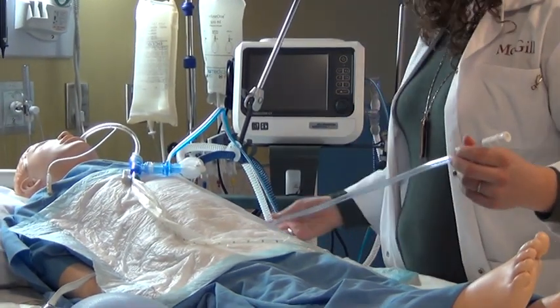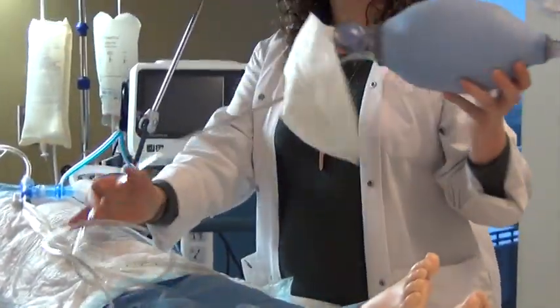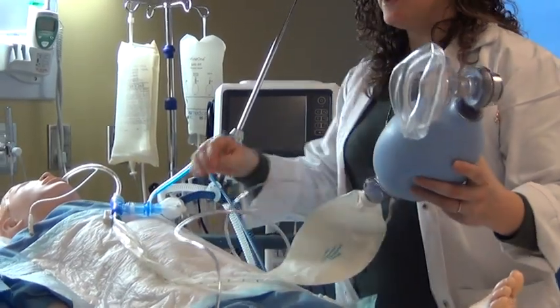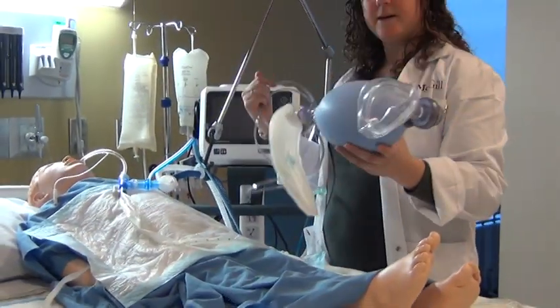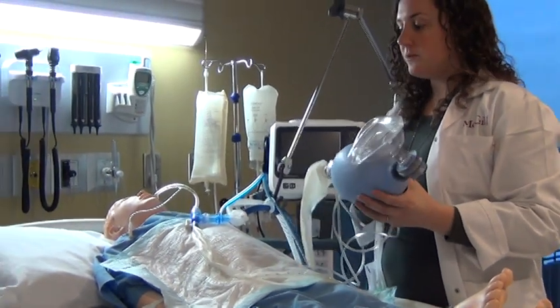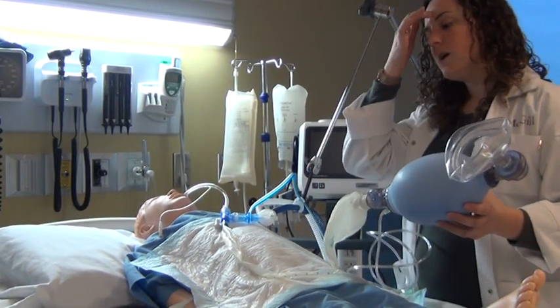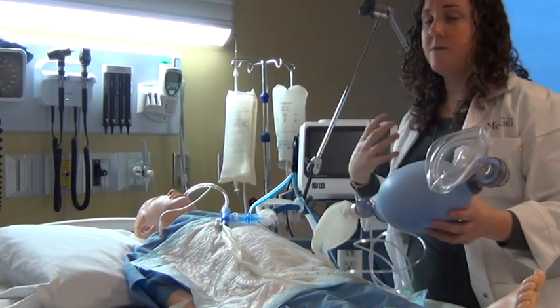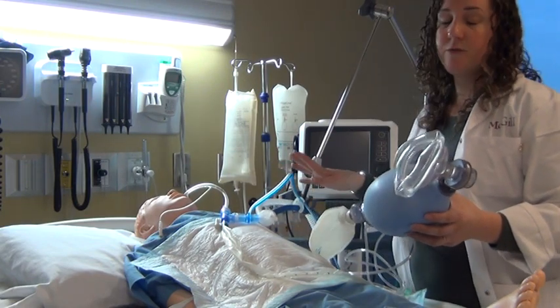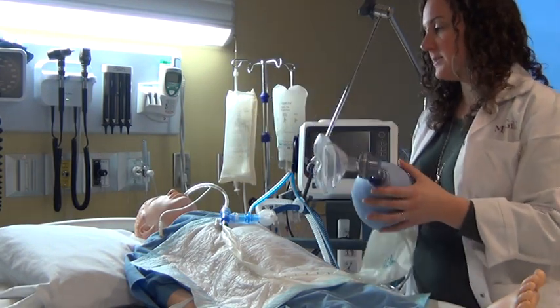Another thing that may be of importance, just that we can demonstrate, is actually the use of a valve mask. So in any type of cardiac arrest, this is the type of device that you would be using to provide the breaths. But there is a chance, for whatever reason, that there's a malfunction with the ventilator, or maybe even a mucus plug, or anything that might be happening with your patient, that you might have to disconnect them from the ventilator and provide them with breaths through this device.